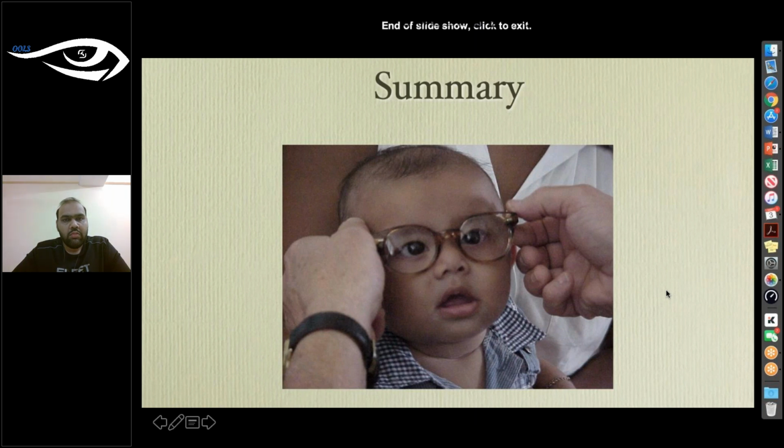Hyvarinen, Leah Hyvarinen, was involved in Scandinavia 30 years ago in the development of techniques to identify young children with vision problems in need of comprehensive eye exams at young ages. And now we're playing around with automated refractive photo screeners, and they look to be quite useful. And we've looked at that as well. As I said earlier, I've done research for Welch Allyn using the Spot, and we've looked at that for children between birth and 3 years of age, and there is clearly value in that.